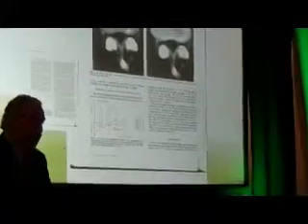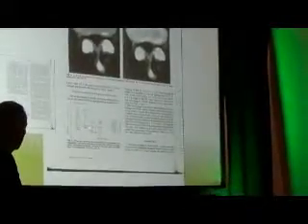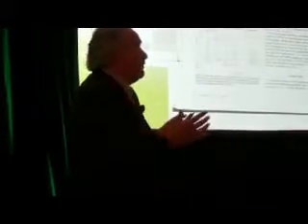Here in flexion, there's an increase in canal size in the cross-sectional area, increase in the mean sagittal diameter, top to bottom, and the ligamentum flavum decreases with flexion. Stretches. So I can create some stretching of the ligamentum flavum, thinning it out, and open up the canal or lateral recess more by doing that. So I can affect the soft tissue through this.